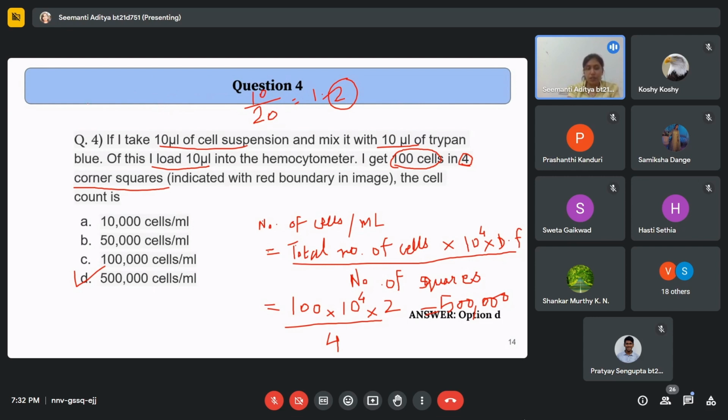So if you are taking 100 microliter of your sample, and putting it in 2 dishes, where you're adding 50 microliter of the sample in each, then it becomes 1:1 splitting. So in this Eppendorf, you have 100 microliter of cells and you are adding 50 microliter. That is 1:1 splitting because you are adding equal amounts of cells in each dish.